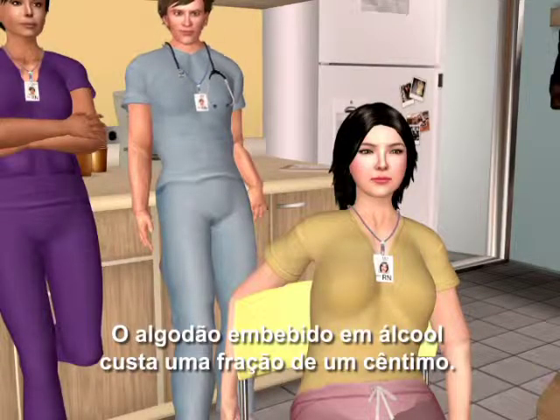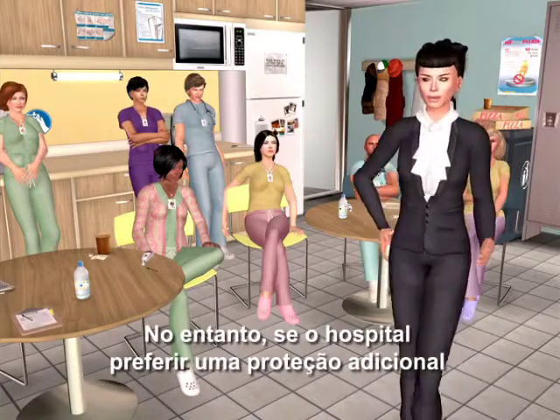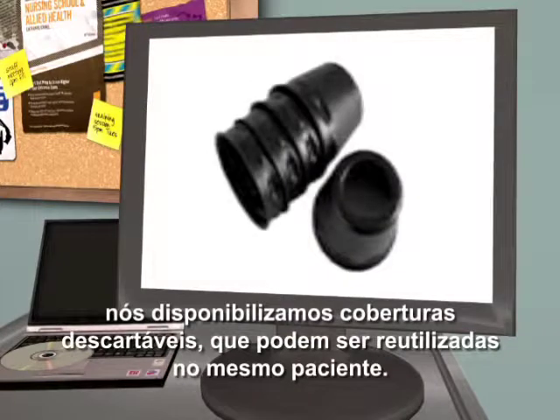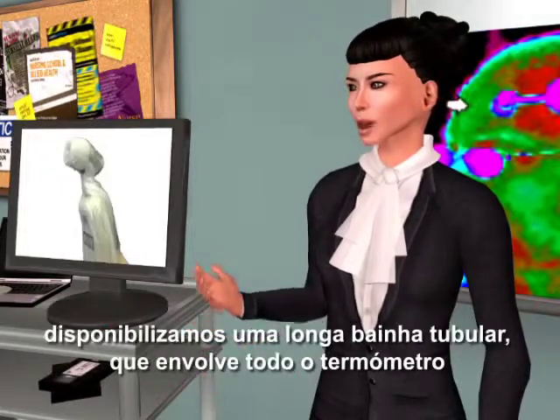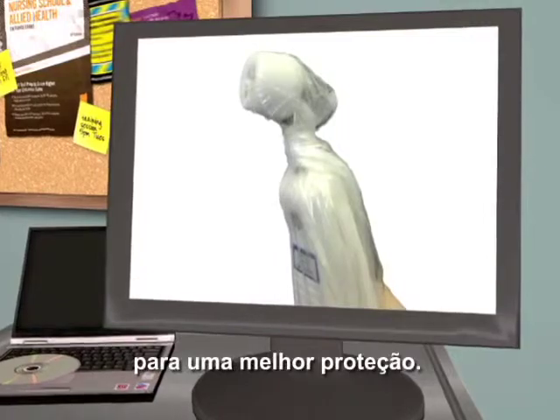Alcohol swabs cost a fraction of a penny. However, should the hospital prefer additional protection for certain patient populations, we offer disposable caps, which can be reused on the same patient. And for isolation patients, we offer a long tubular sheath that encloses the entire thermometer for optimum protection.